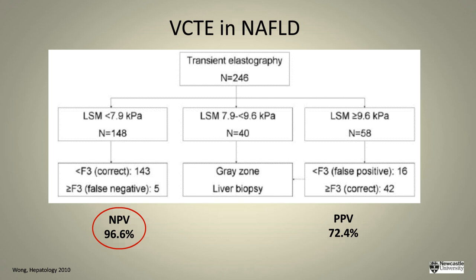Now, comparing this to FIB4 and NAFLD fibrosis score, if you were to look at this data set and say, okay, if you took a liver stiffness measurement less than 7.9 kPa, that ultimately you would detect people with less than F3 disease 97% of the time. And that is exactly what FIB4 and NAFLD fibrosis score does, is it excludes people with F3 and F4 disease with a high degree of accuracy and a high negative predictive value. So comparatively, this study does the same thing. This device does the same thing very, very well.